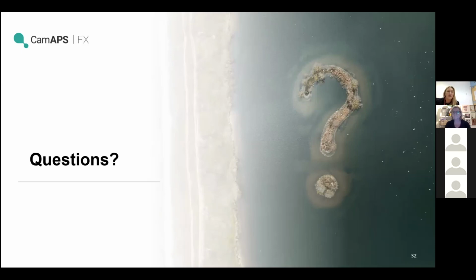I think there's a couple of other things around the set change. It doesn't have its own internal syringe driver. It's still a similar system with a linking screw, but they've adjusted the way that you set the screw length with a different kind of setter. And also there's a window at the bottom so you can check it's all engaged properly. So they've tried to iron out some of those things that people struggle with on the Dana RS, which I think will be good.